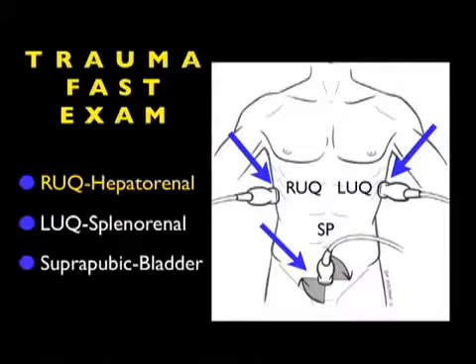So in conclusion, I'm glad I could share with you this Part 2 module on the right upper quadrant view of the trauma FAST exam. I hope now you have a better understanding on how to perform a complete exam, looking into the three areas as we discussed: infradiaphragmatic, Morrison's pouch, and inferior tip of the liver. And hopefully now you'll be able to discern the presence of fresh blood versus clotted blood on bedside sonography.